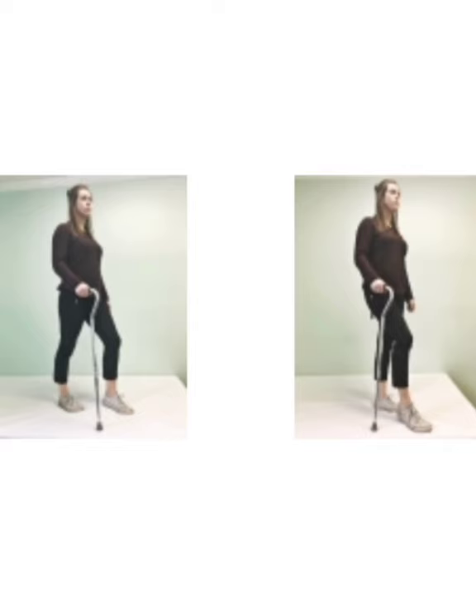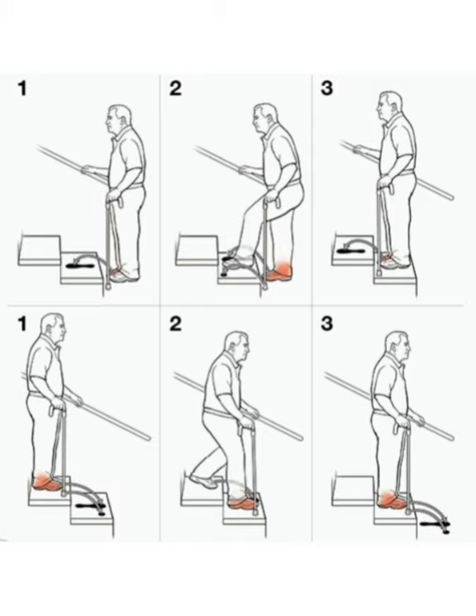When ambulating stairs or steps, use handrails for extra safety whenever possible. Indicated in red will be the weaker leg. When going up, you step with the foot closest to the cane first — your stronger leg — followed by the cane and opposite foot.